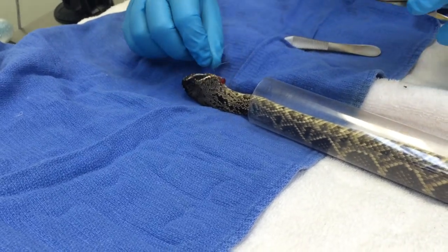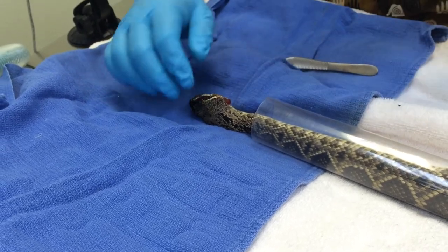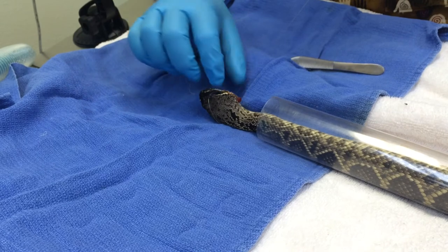Now, is this absorbable suture? Yes, it is. Sweet. I'm about to make a knot. Not one I wanted.